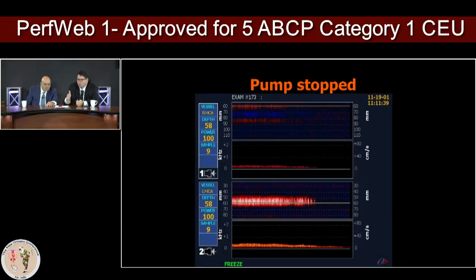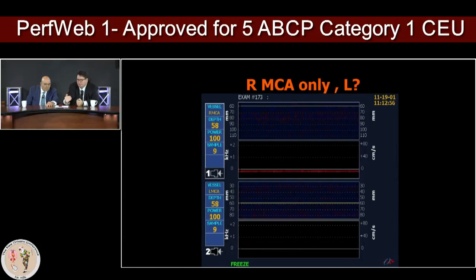So when you are stopping the pump and you would like to have a retrograde cerebral perfusion, indeed the flow in the middle cerebral artery can be detected in a reverse fashion. So you need to overcome that capillary opening pressure, at least like 40 millimeters of mercury, and you can increase the retrograde cerebral flow from 500 up to 600, 700 to open up that flow. After that, you can decrease it, and we can detect the flow up to 450. And I think this is, you want to prevent edema.